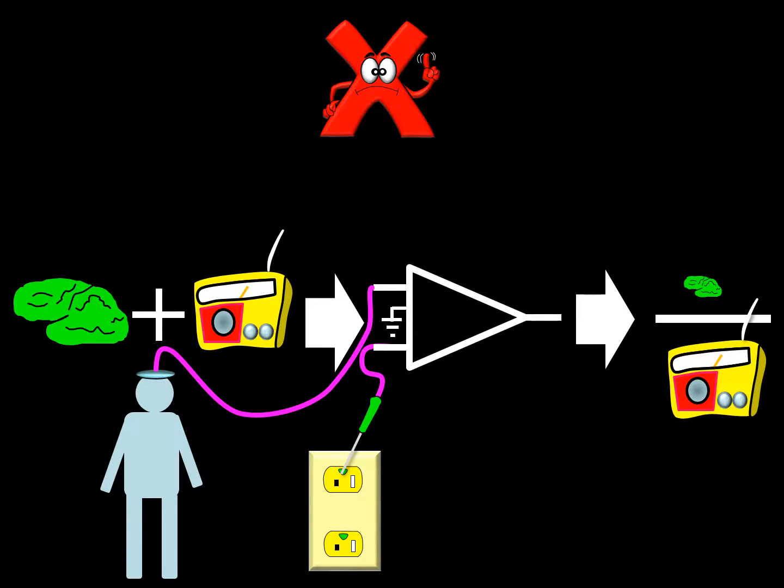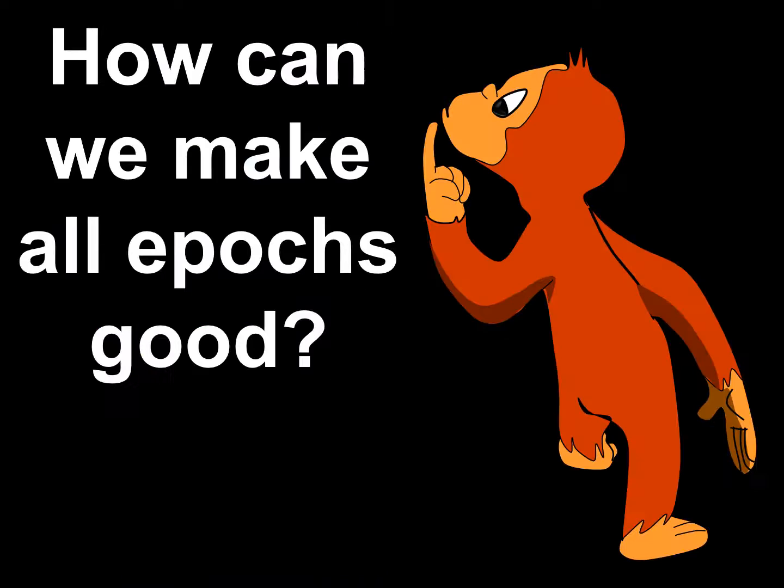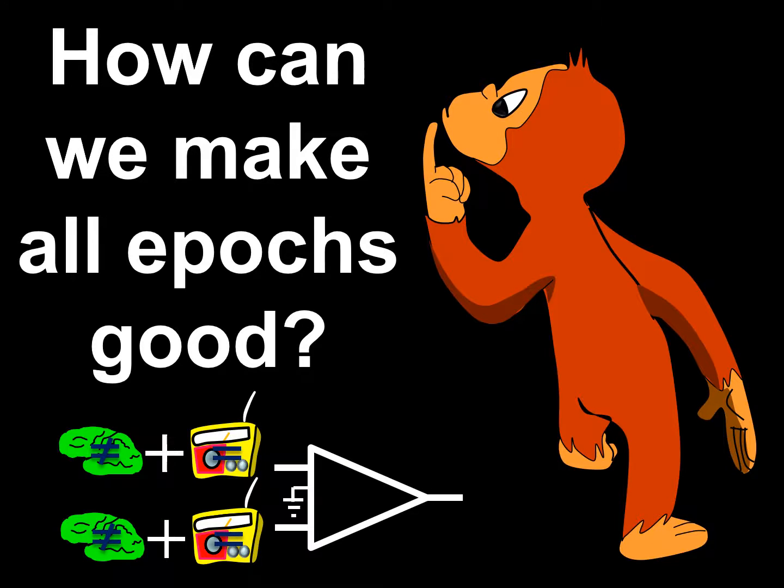So connecting input 2 of an amplifier to the ground was a bad idea for two reasons. One, a noise-filled EEG, and secondly, as you can imagine, danger of electrocution. Next, they considered connecting the electrode of input 2 of the differential amplifier to a different body part. Again, this was done with the hope of capturing unequal brain electrical activity and equal noise.